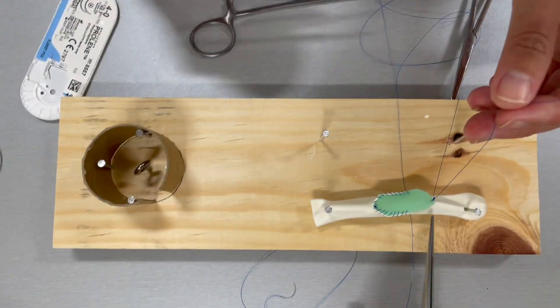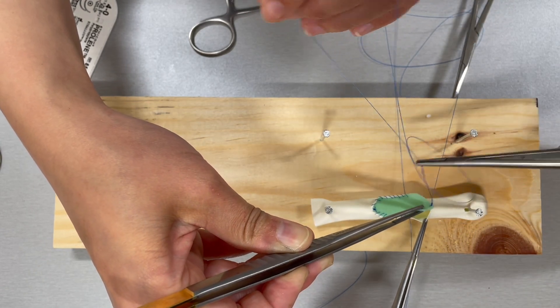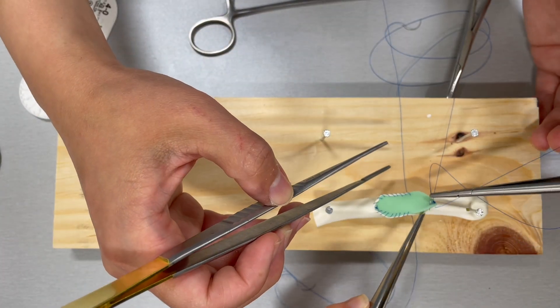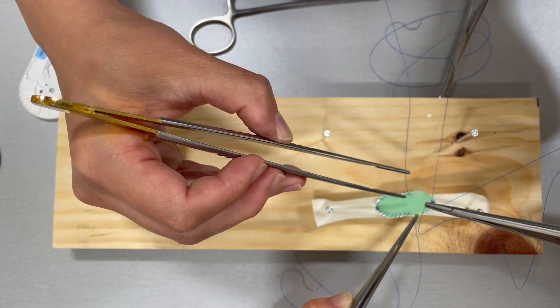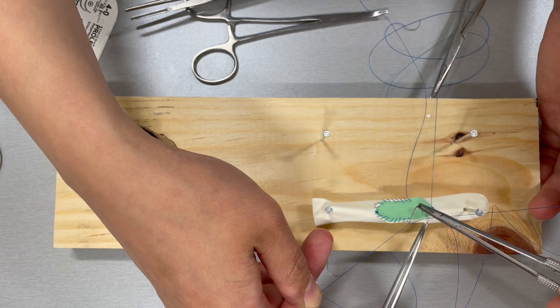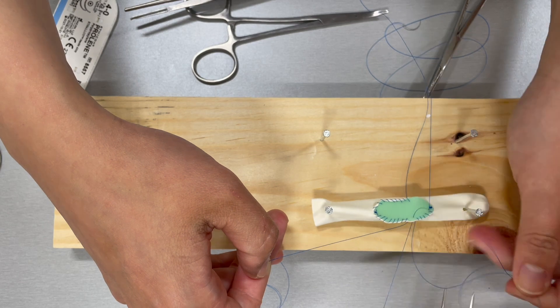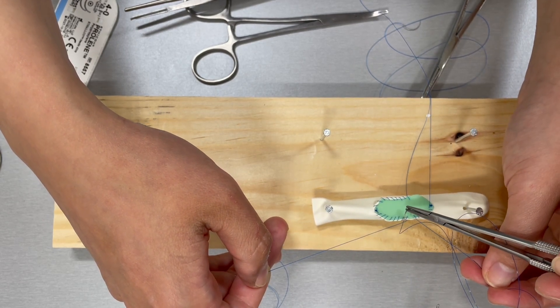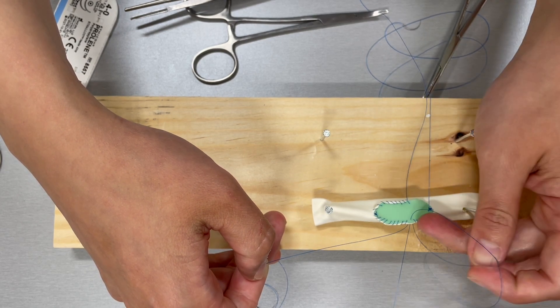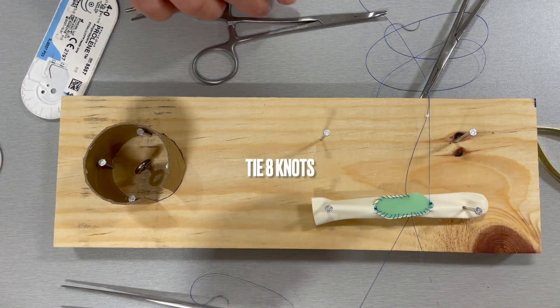Start at the apex and run the proline forehand from the apex to the middle of the incision. At the middle of the incision, tie the suture to the previously placed suture.